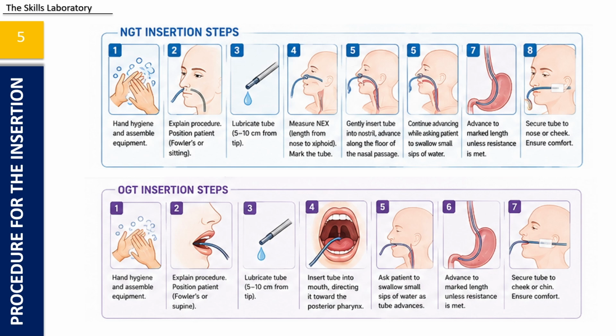However, there are patients wherein you have to insert NGT in patients who are GCS 3 or in coma, those patients who are in the ICU. So you cannot position the patient properly unless you have help together with the nurses. Proper positioning would actually help you to correctly insert your tube.